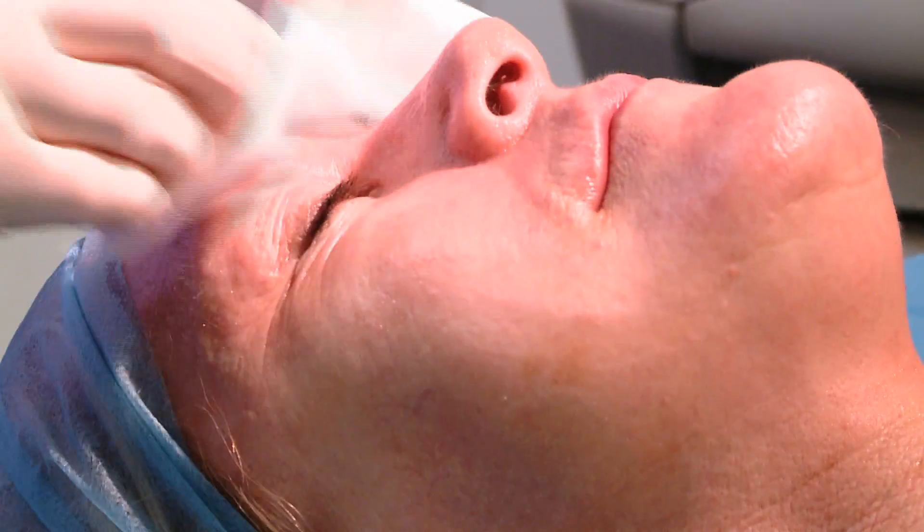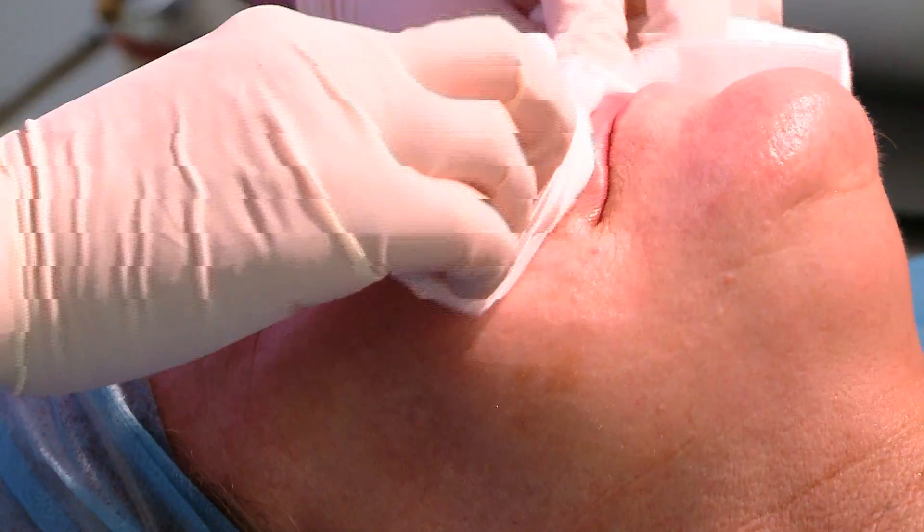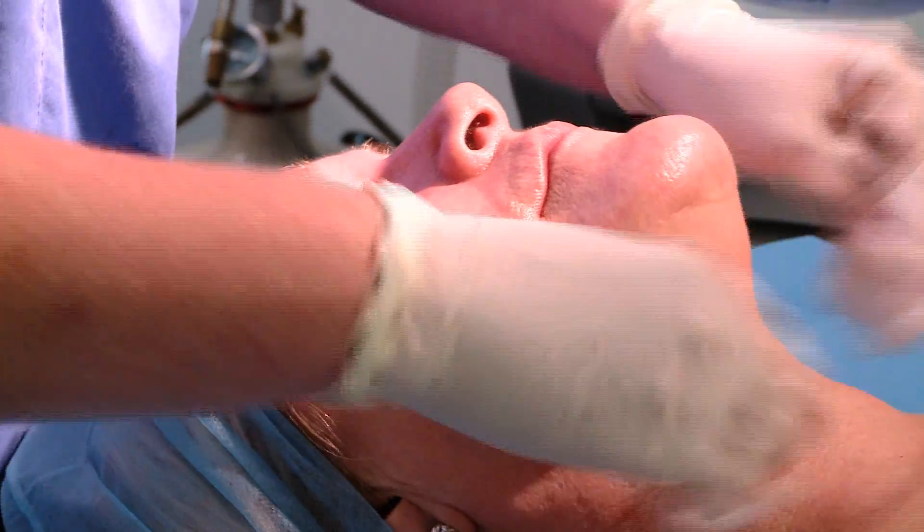The next stage involves removal of the anesthetic cream from the face of the patient. Carbon dioxide lasers tend to be attracted to water within the skin, and because there's a high concentration of water within the saline and gel of the lignocaine we're using, the laser would obviously tend to focus its vaporization at a layer above the epidermis, which is what we don't want. We want to attract it to the water in the transitional zone and within the epithelium itself.